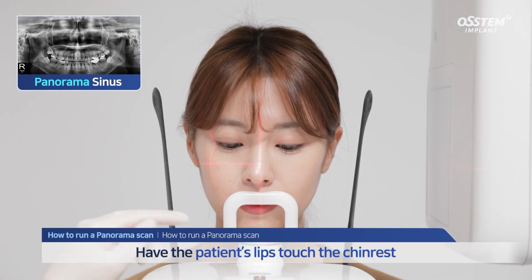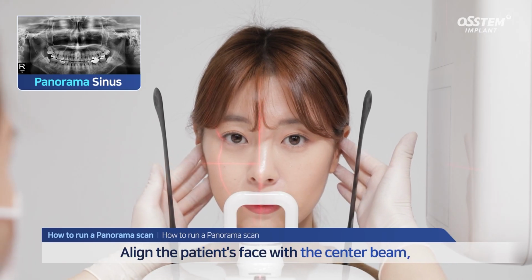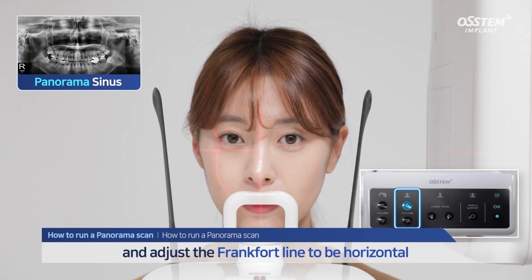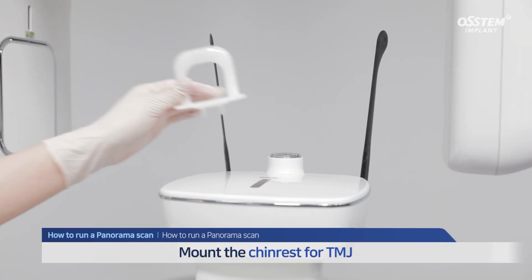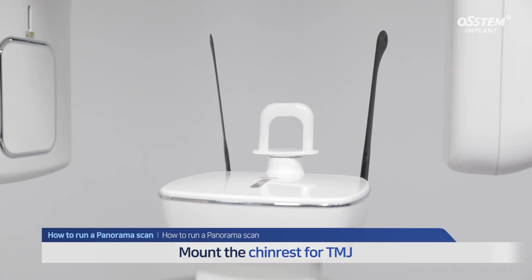Have the patient's lips touch the chin rest and fixate the face. Align the patient's face with the center beam and adjust the Frankfort line to be horizontal. Fixate the head to start scanning. Replace the chin rest with the one used only for TMJ scans.